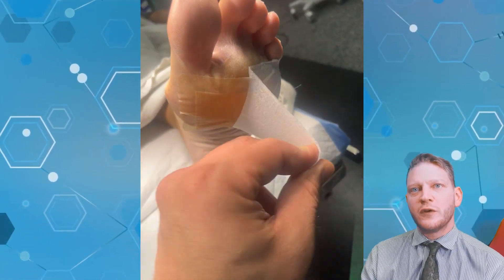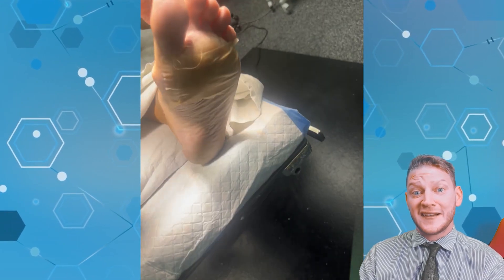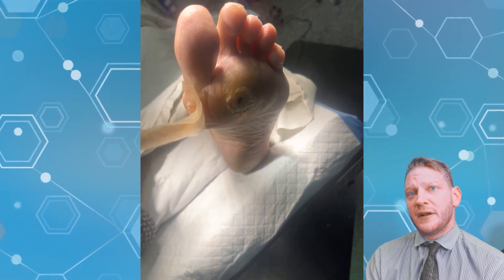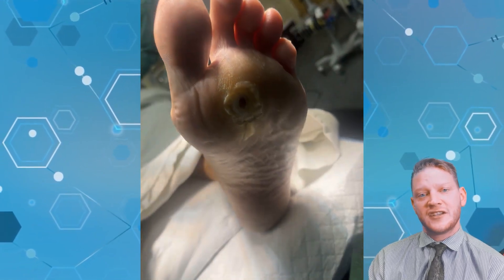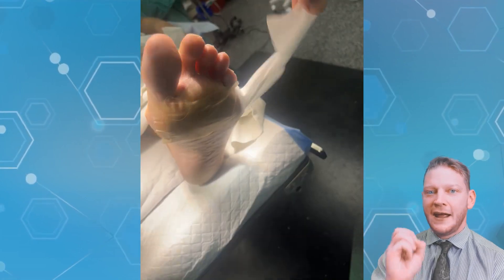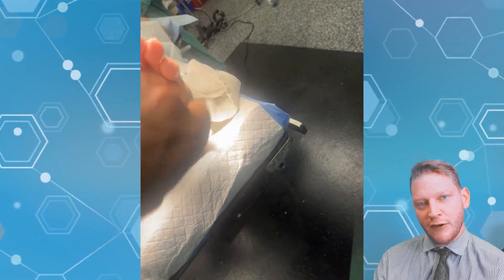Here we are taking off the wound dressing and you can see what this wound has been looking like for the last year or so. It took a while to convince our friend here that this was necessary. But these wounds are very common and it just takes one day for the wound to get infected with some gnarly bacteria — and then you have gangrene of that second toe.